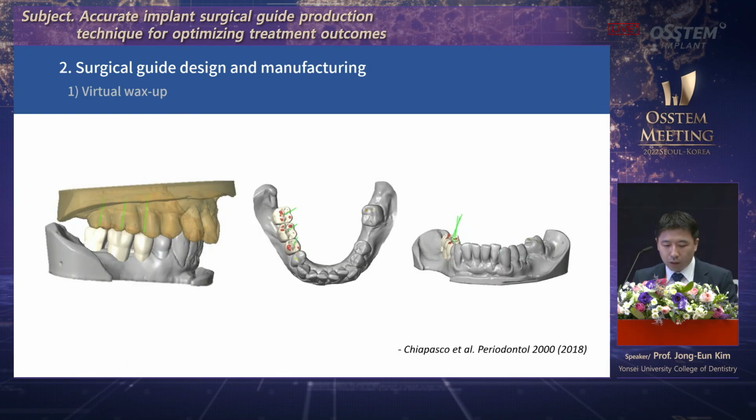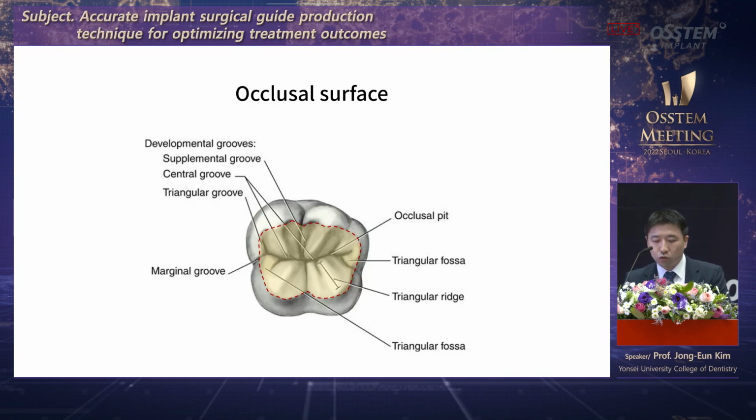You need to understand it thoroughly before we proceed on the posterior area. You not only arrange and align teeth, but at times you reduce the occlusal table. You need to consider these designs ahead before we move on to surgical guide fabrication. To do this, accurate impression taking or scanning is very important.